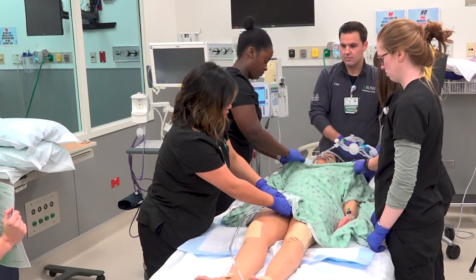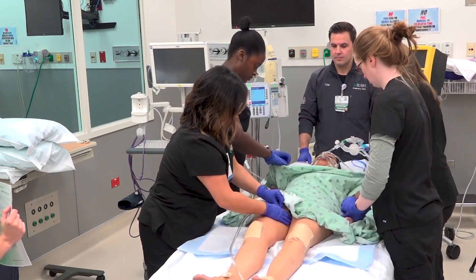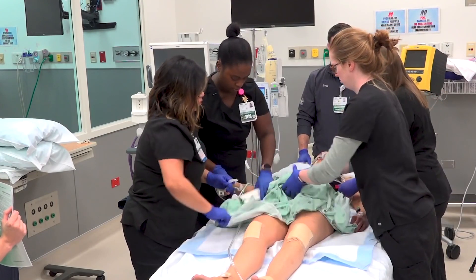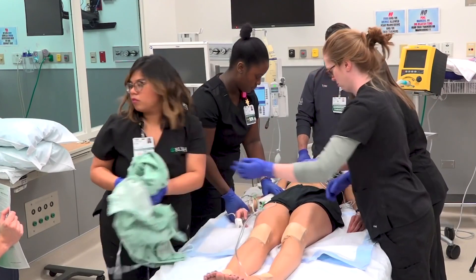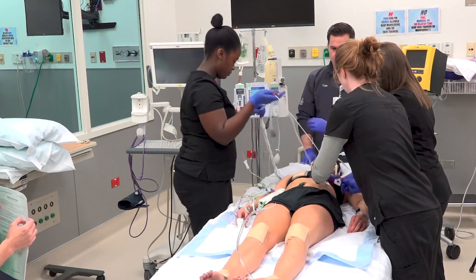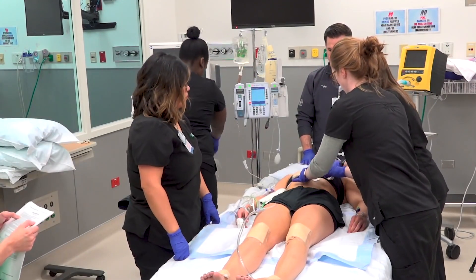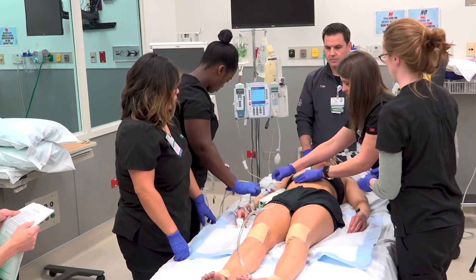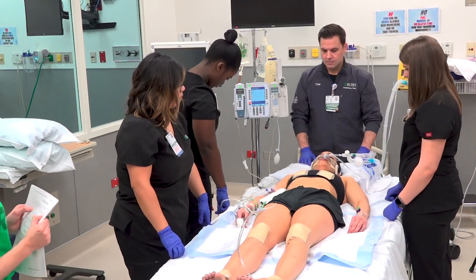The next step is to remove the patient's gown, EKG leads, and EKG electrodes. We will ensure the transducer of the patient's arterial line is taped to the patient's side of the chest where the invasive lines are located, so that we can continue to monitor the pulse in the absence of telemetry.